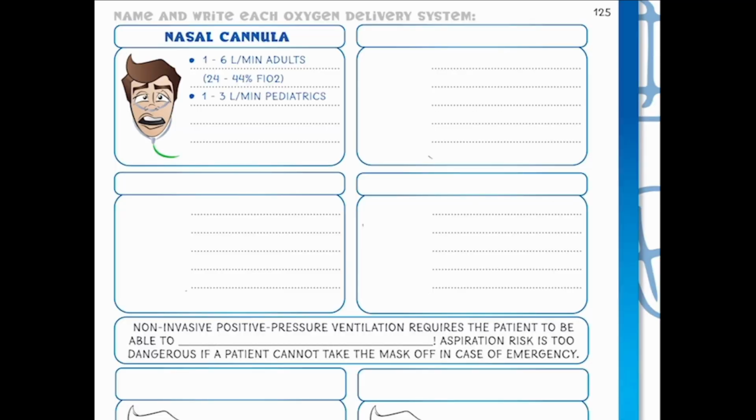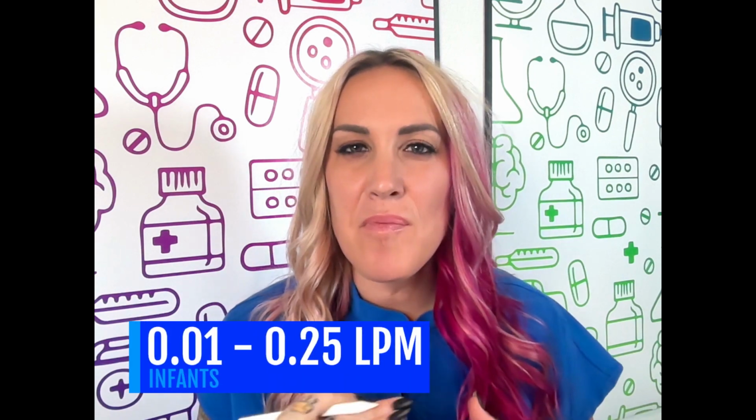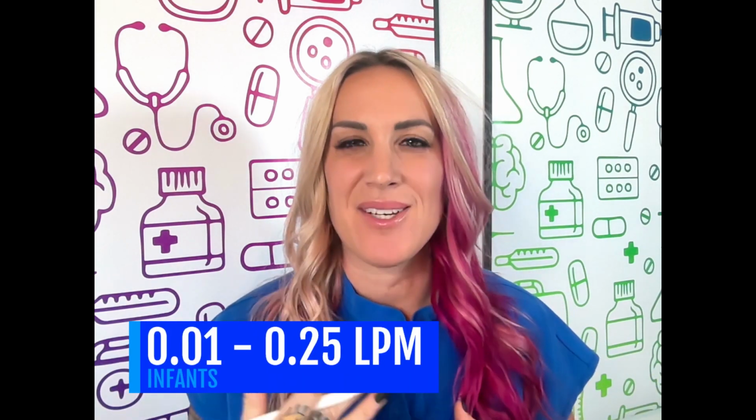But in our pediatric patients, we're going to need a smaller nasal cannula, because not only are their little noses much littler than ours, but we're also gonna dial back that flow, how many liters we're putting in. So our pediatric patients get 1 to 3 liters per minute through their pediatric nasal cannula. And in our infants, we can actually give 0.01 liters up to 0.25 liters per minute. As you can imagine, these cannulas are so tiny and need little stickers to keep them in place. Most of our babies don't like it, but eventually they'll forget that it's even there.